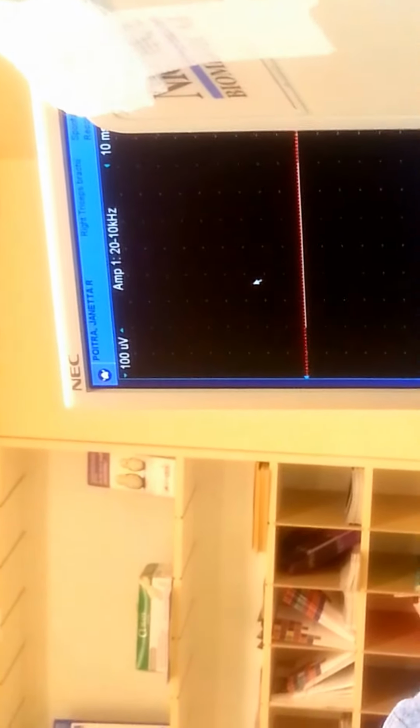Okay, now let's go to C7, back of the arm. Triceps. So let's have you cross your arm across your chest. And we'll find this muscle back here. This is the one that straightens your elbow. Okay, so we'll try to get right to it. Poke, hang in. Ow! I know, it hurts, the skin hurts the most.